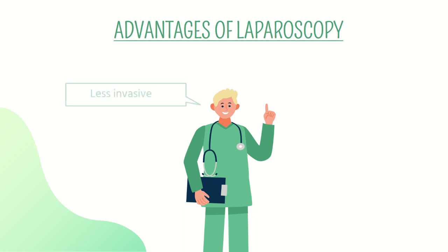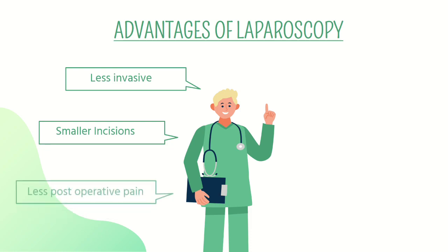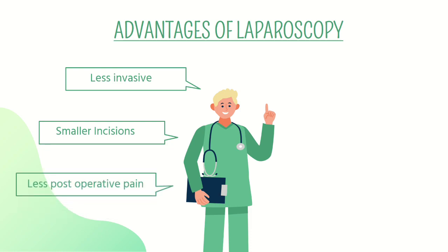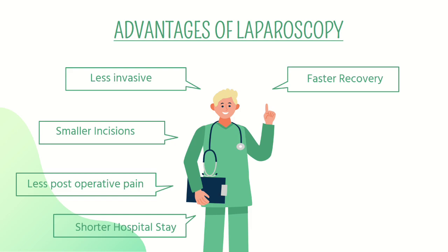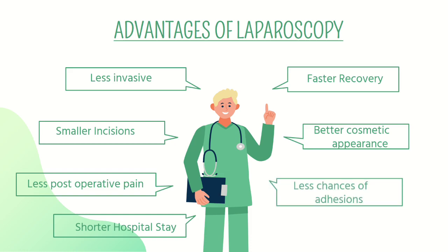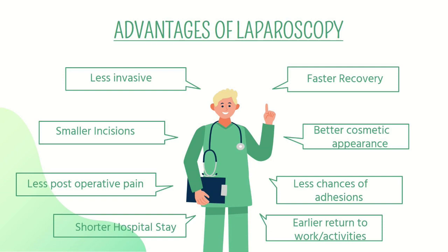First, laparoscopy is less invasive than an open surgery, and because it has smaller incisions, the patients would have less post-operative pain and a shorter hospital stay. This means patients have a faster recovery rate. Laparoscopy also has a better cosmetic appearance due to its distinct small incisions. There are lesser chances of adhesions in MIS, and it would mean an earlier return to work or daily activities for the patient.